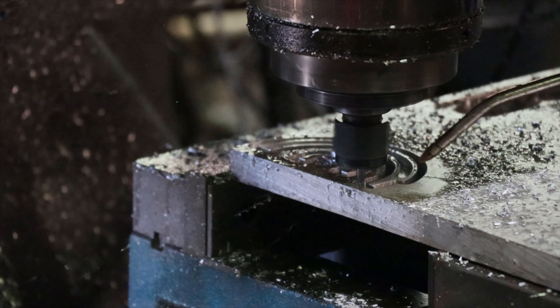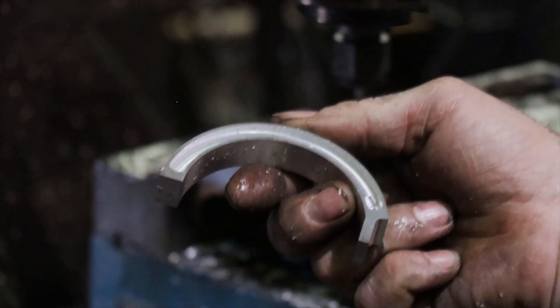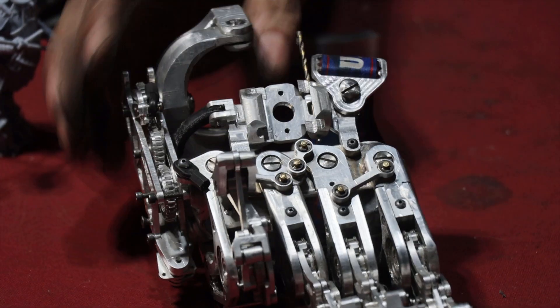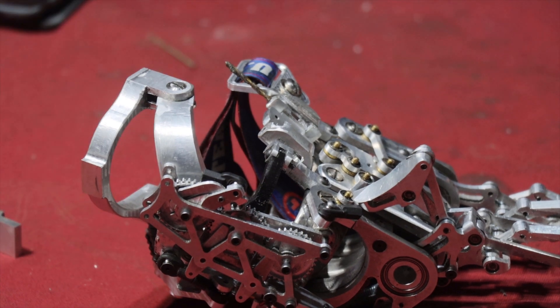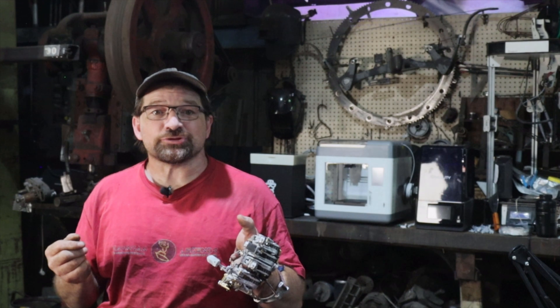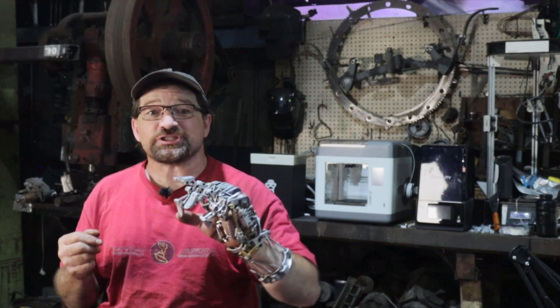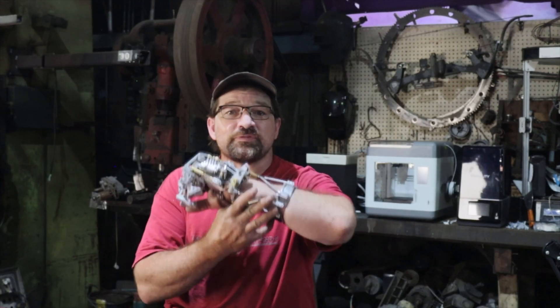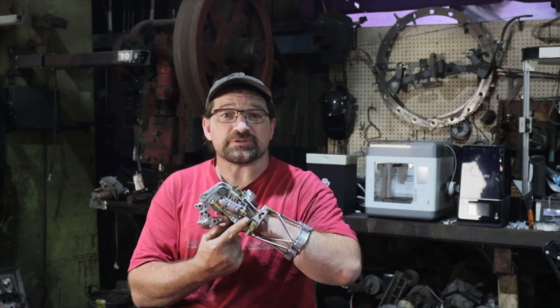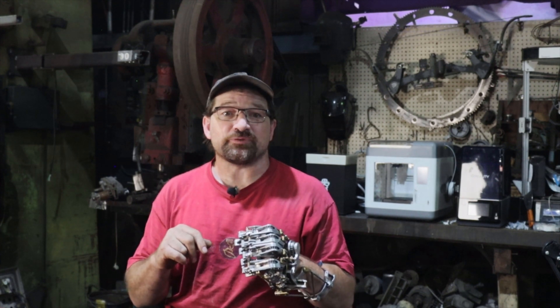Most of my effort this last week has been focused on designing the forearm assembly. In previous iterations, this assembly has been pretty simple, but the functionality of this version is going to need to be a little more complex. On this hand, I'm isolating the driving motion that splays the fingers from the motion that changes the grip pattern. On the 158 hand, I used the lateral motion of the wrist to drive the finger splay, as well as the scotch yoke that changes the grip patterns, by having the endpoints at different positions and a decent amount of over-travel between the functions.